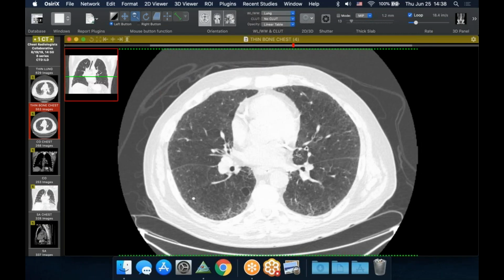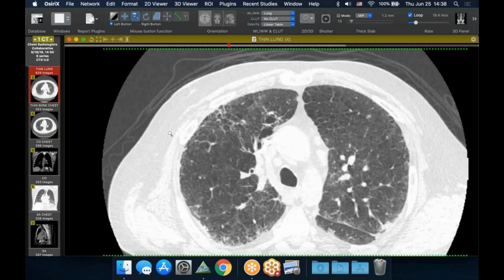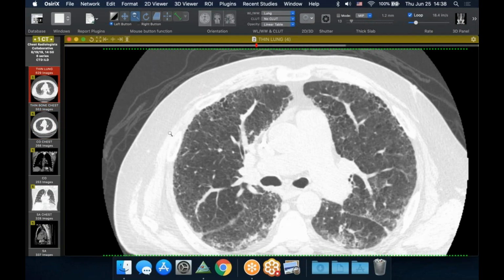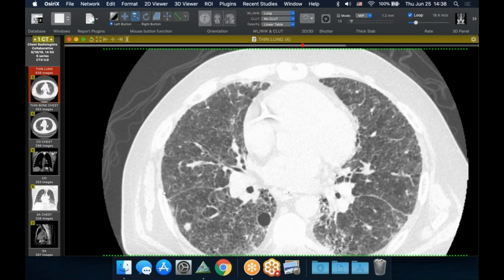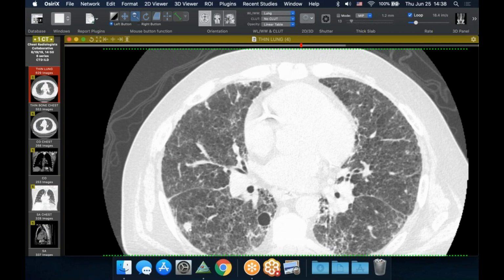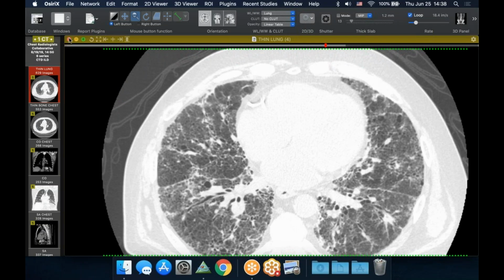There are some large nodules in there. I'm not sure what those are related to at the time, but just kind of a rapid change over the course of 11 months. So a really bad case, and those are those nodules. I don't know if those are some lymphoid aggregates or something else related to it.